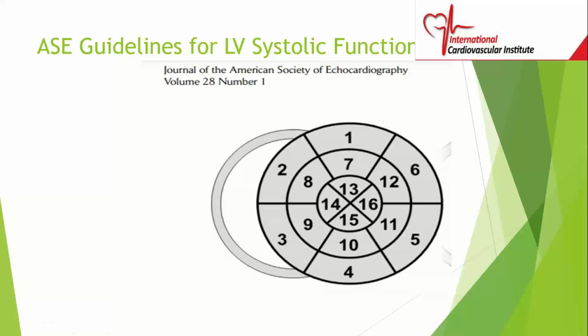And then we move from the mid segment to the apex. Inside the innermost circle is the apex. We divide the apex into anterior wall, 13, inferior wall, which is 15, septum, which is 14, and the lateral wall, which is 16. So we combine everything and we call it a polar plot.